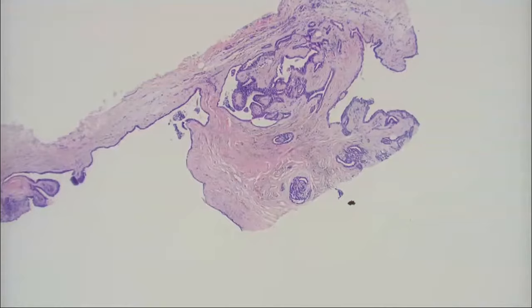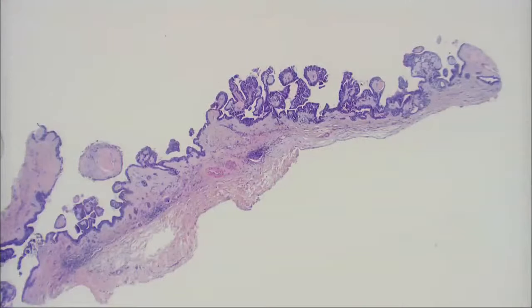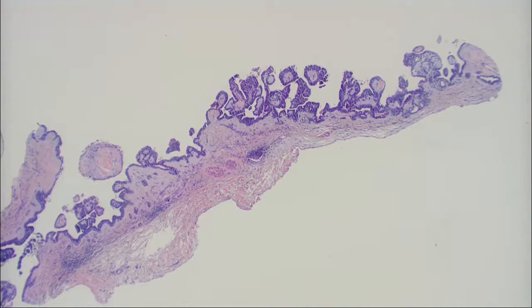There's a couple of other things that fall into this general category. One or two other entities that look kind of like this, that are apocrine, and they're kind of like cystadenomas. Like SPAP? Yes, syringocystadenoma papilliferum. And what's the other one?